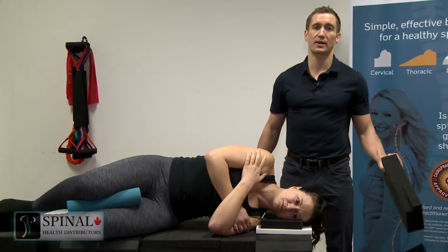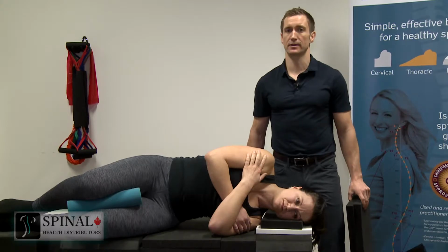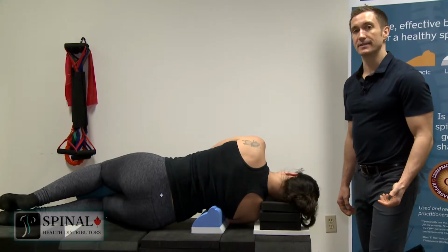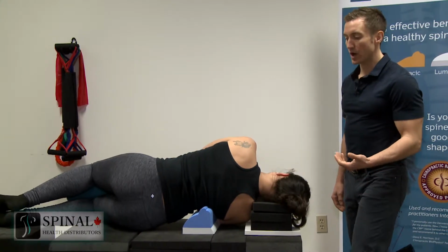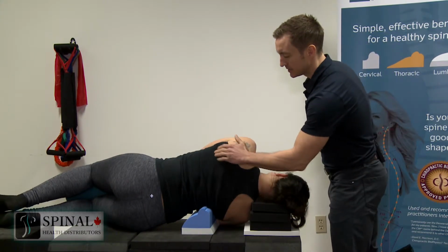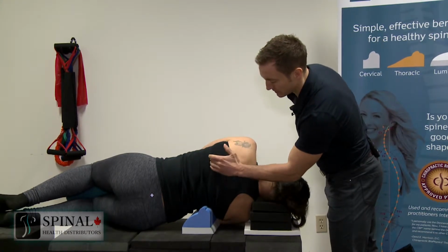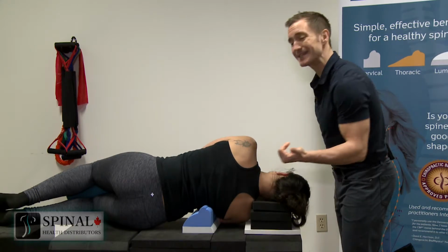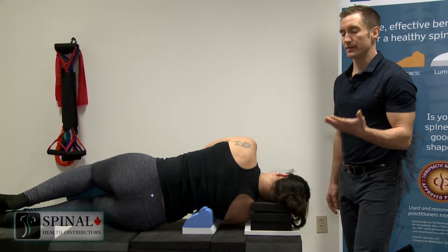So let's go ahead and show you guys now how to use the thoracic Scoliroll. So now we have a patient laying on the thoracic Scoliroll. Again we want the peak at the apex of the curve, and here we see the tip of her shoulder blade. The peak of the Scoliroll is slightly below the tip of the shoulder blade, so here it would be about T8 or T9. The same principles apply.